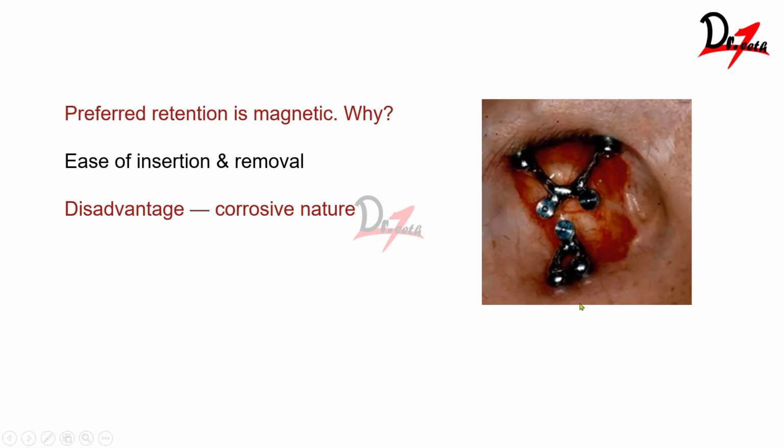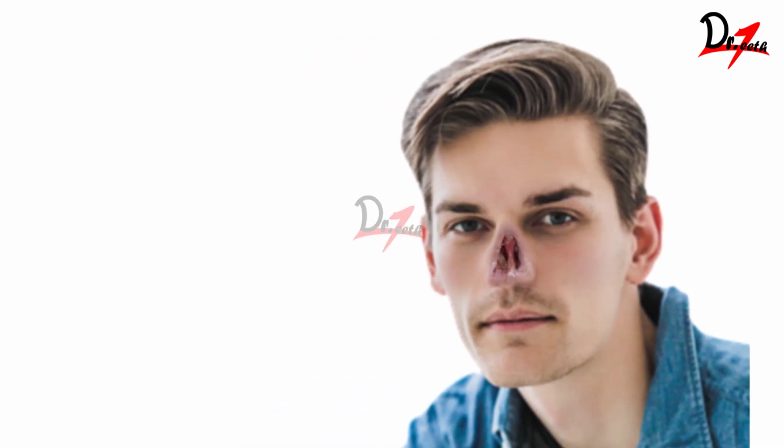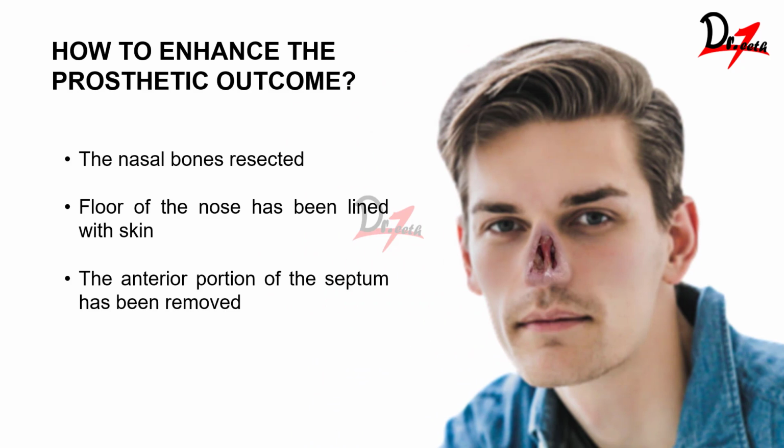The only disadvantage of magnet is that it is corrosive in nature, but that's not a great problem for the extraoral environment. Coming to the nasal defect. Now, the patients of nasal defects are really less in maxillofacial field. Why? Because by surgery alone, most of the cases can be corrected and they are aesthetic also. They are providing function also. They are providing aesthetic also. But for the extensive defects, we may need to make a nasal prosthesis.